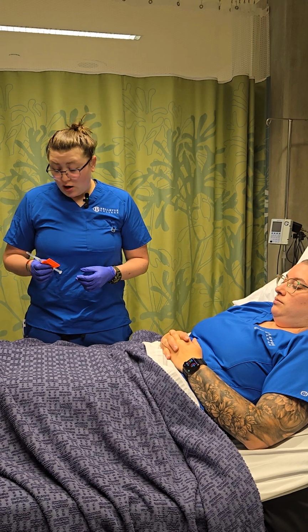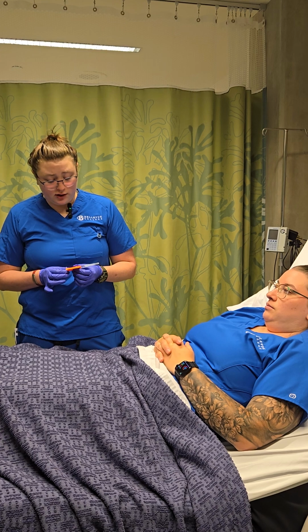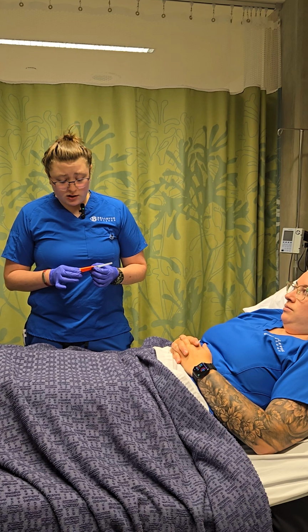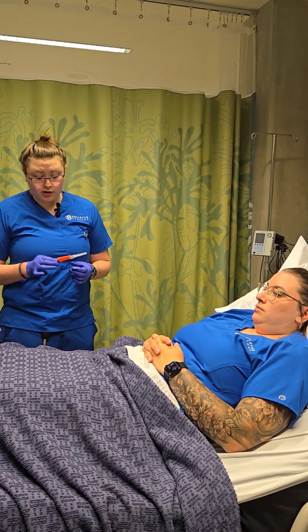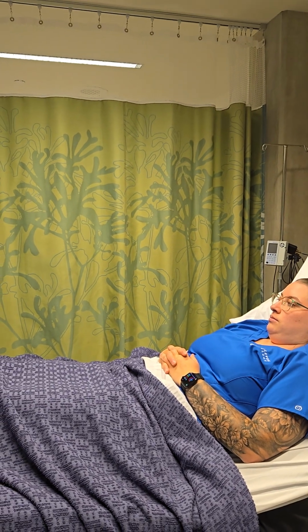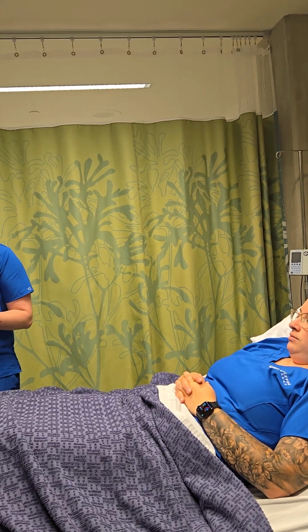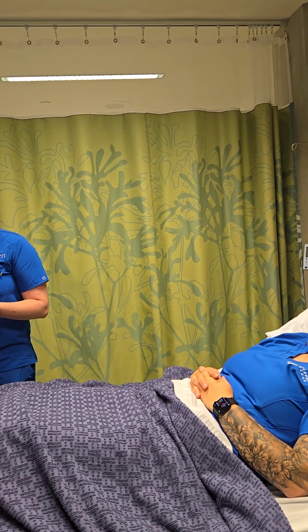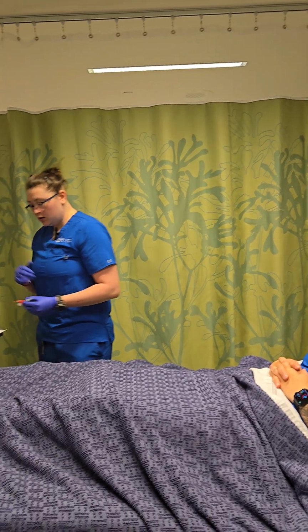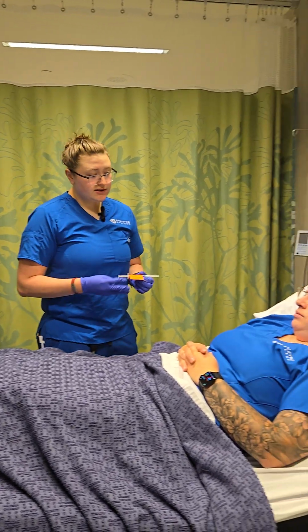Okay. So for the Toradol, we already ascertained that you're in 7 out of 10 pain. We already ascertained that you don't have any GI bleeding risks at the moment, which is great. Good work. Keep that up. So now we're going to go through the medication rights for the Toradol. It's the right drug, it's Toradol. It's the right amount, 20 milligrams or 1.3 milliliters. It's the right route, intramuscular. It's the right time, 9 a.m., and it's the right patient, Mary Smith. Good. Scan your wristband. Scan this. Excellent. Going to grab a new alcohol swab. There are 3 places that I could put this.